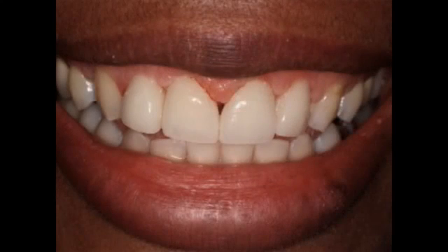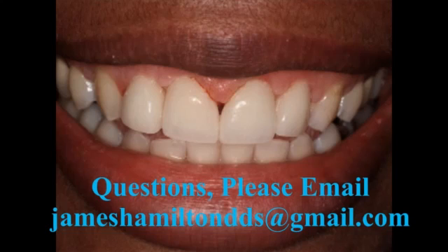In 2 weeks, the veneers came back. They all fit. We cemented them, and then, I'll answer your question in just a second. We cemented them, and the patient went home and was very happy. Now, let's say the veneers didn't fit. The impression I used was a polyvinyl siloxane bite registration material, extremely dimensionally stable. I saved that impression in case these didn't fit so I could reproduce the same composite veneers that I did originally. The question I'm almost positive you're going to ask is, how were those veneers held in place?